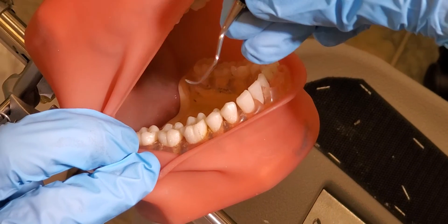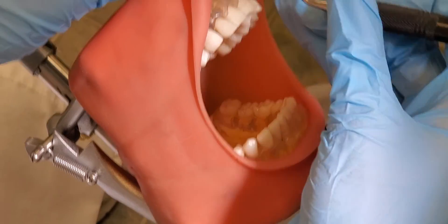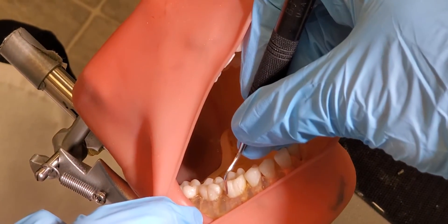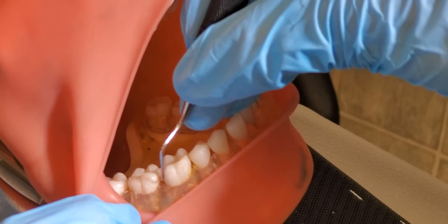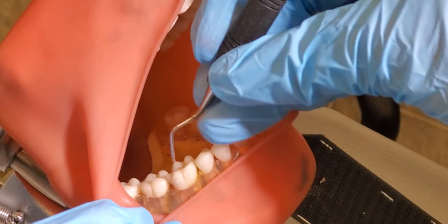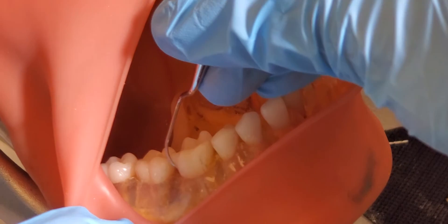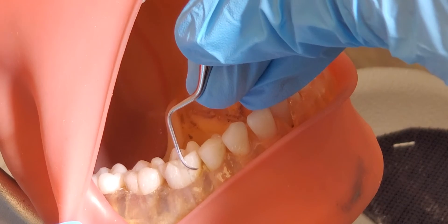Posterior teeth are going to be a little bit different than the anterior teeth. We're not going to divide the tooth in half to do surfaces towards and away, but we're going to make sure we have a good modified pen grasp and a good fulcrum. We start at the distal line angle of the tooth with the tip pointed distally — you can see that right there — and we're just going to roll right around and pivot. Then, without picking up your fulcrum, roll the instrument all the way back so that the tip is pointed mesially, which is the direction we'll be going.